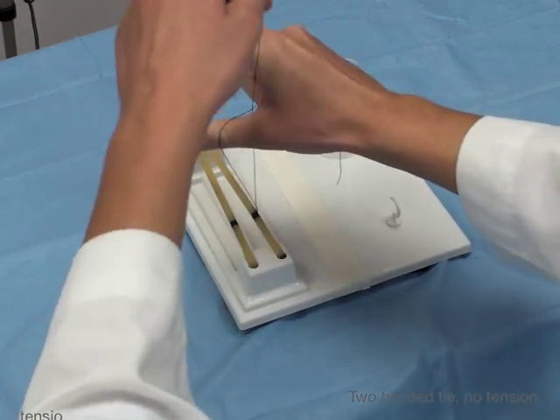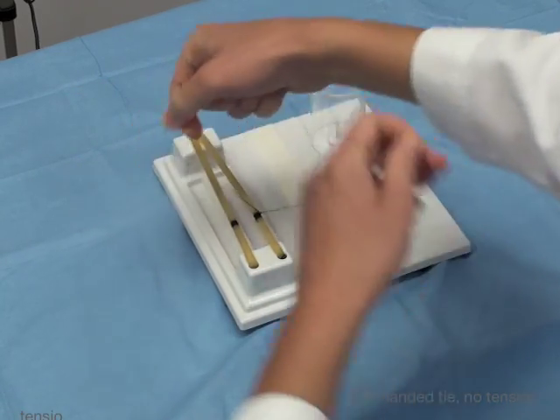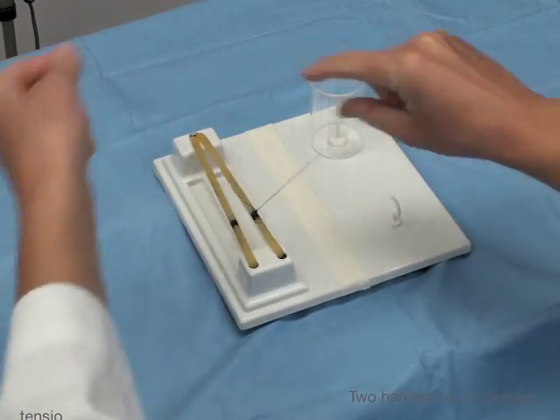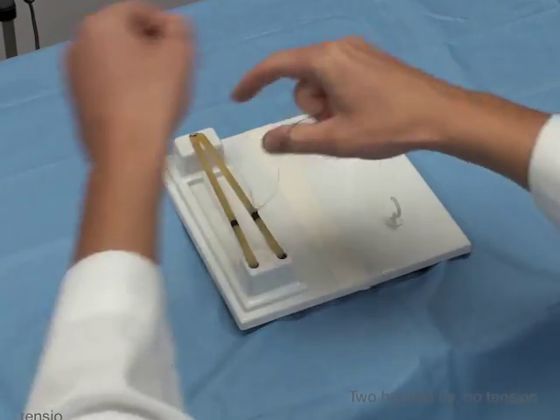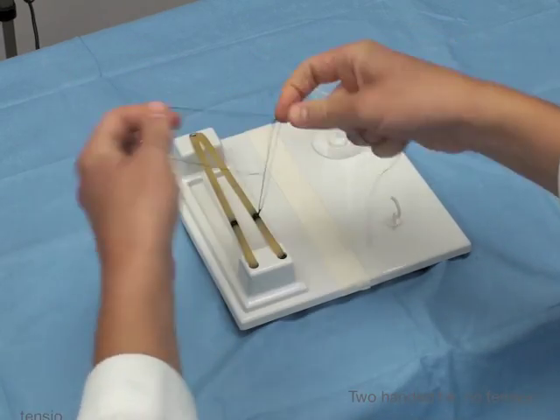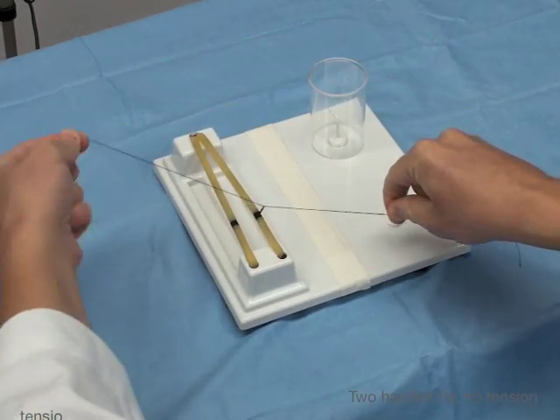Hook with the thumb, cross, perfect sign, push it through, pass it, grasp it, cross your hands to make it lie flat. I'm going to do several of these to demonstrate what we're doing. These are lining up nice and square. By crossing your hands you set yourself up for your next throw, and that's the benefit of doing that.